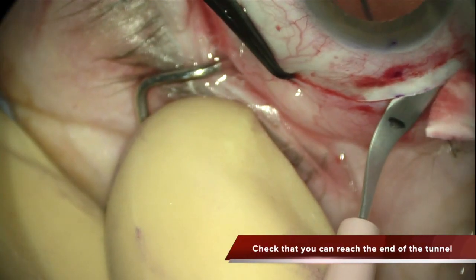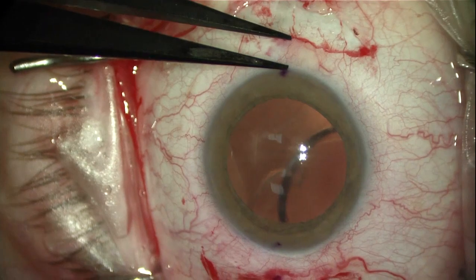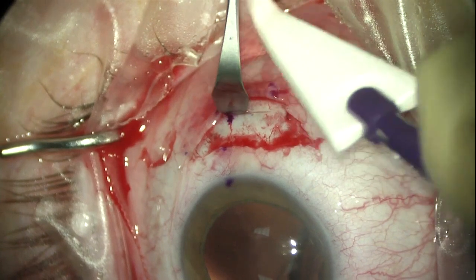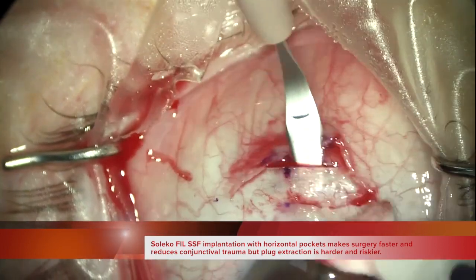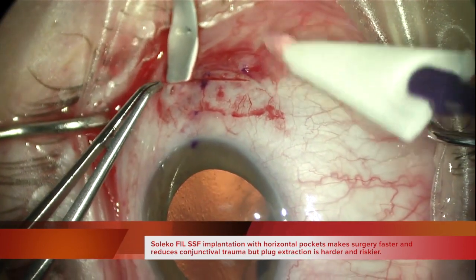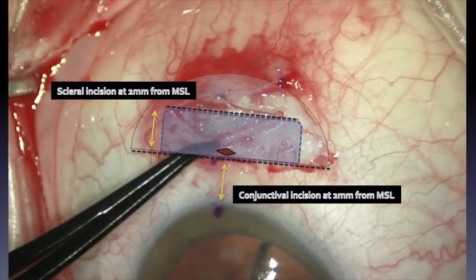Once the tunnel is created, the lid of the tunnel has to be lifted in order to check that you can reach the end of the tunnel, where the IOL plug is going to be buried. To be able to open the lid of the tunnel, you need a very long scleral tunnel — it has to be 6mm long but only 2mm wide, and one half scleral thickness — because you need to be able to lift the scleral lid to find and take out the IOL plug.